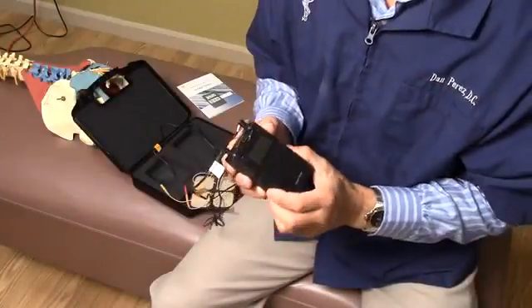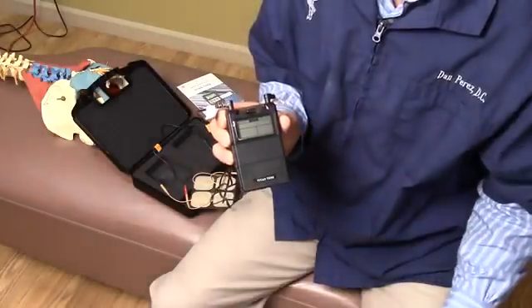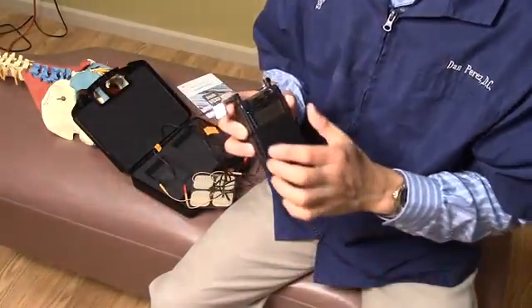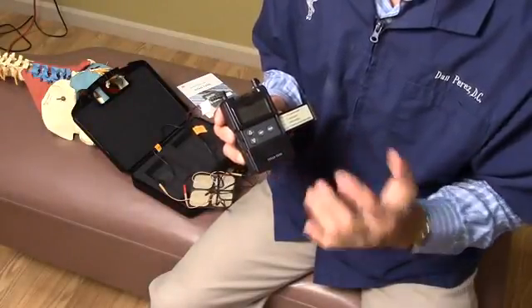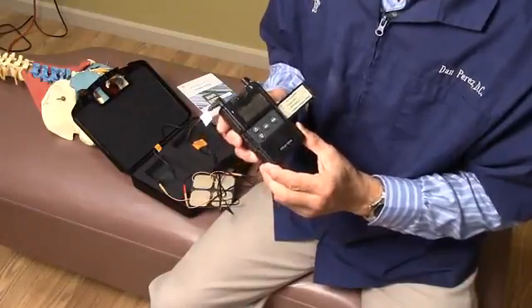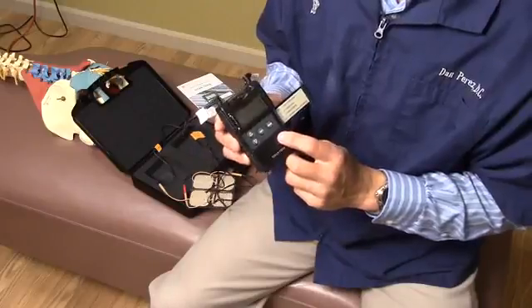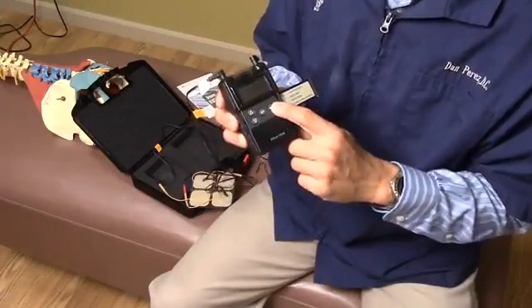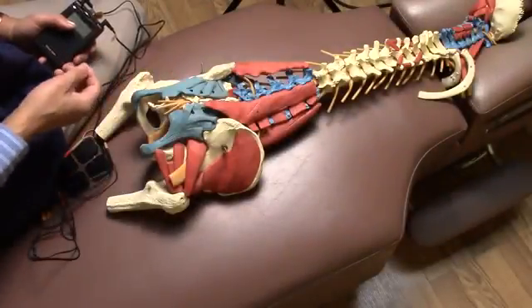Okay, so we're almost ready to go. This is the LED display that will show you the amplitude and frequency of the electrical current that you're using. And this little area here allows you to change the intensity of the frequency and the amplitude of the electrical signal. The TENS unit also comes with pre-selected therapy modes, and you could select between them pressing this button. What I have here is a spinal model with muscle attachments.